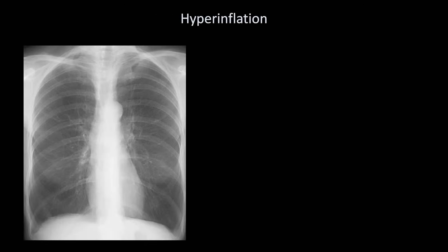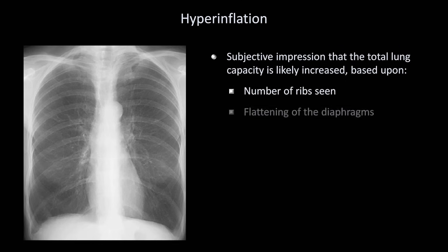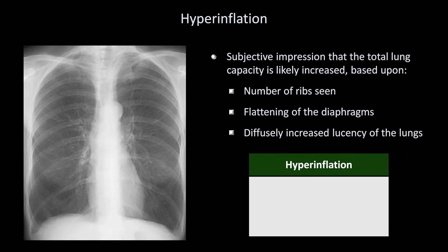In contrast to low lung volumes, we can instead see hyperinflation, which in my experience is less common. There is no widely applied precise definition of hyperinflation on x-ray. Instead, the term refers to a subjective impression that the total lung capacity is likely increased if measured by pulmonary function tests. This subjective impression is based upon the number of ribs seen, flattening of the diaphragms, and a diffusely increased lucency of the lungs. Hyperinflation has a very short and specific differential diagnosis: it is most commonly seen in COPD, and can also occur occasionally in asthma, but only during acute exacerbations.